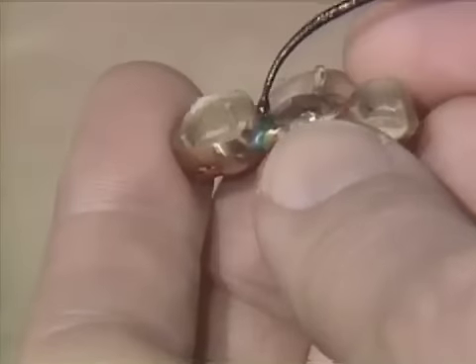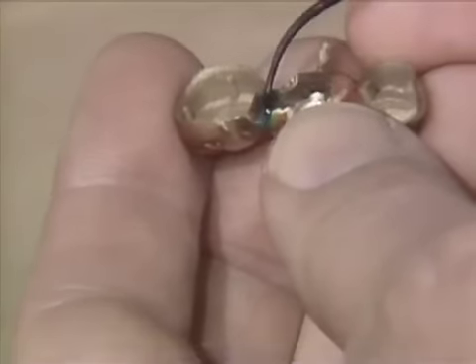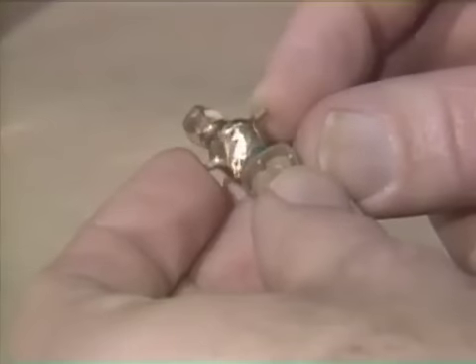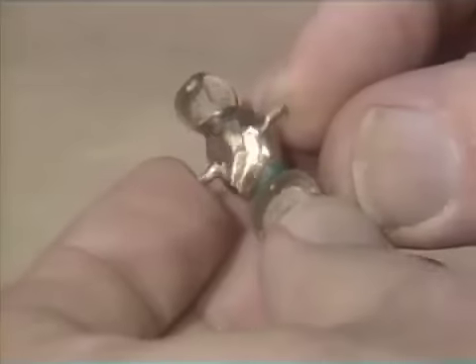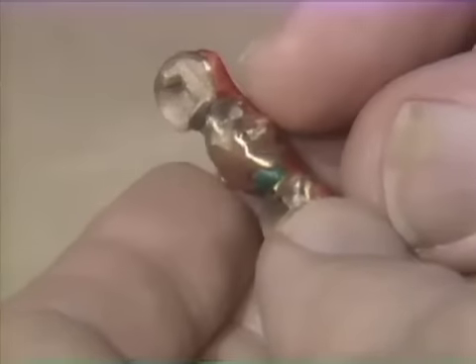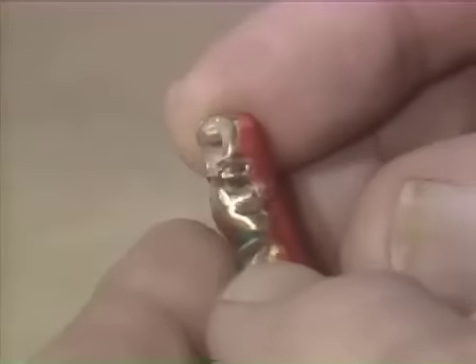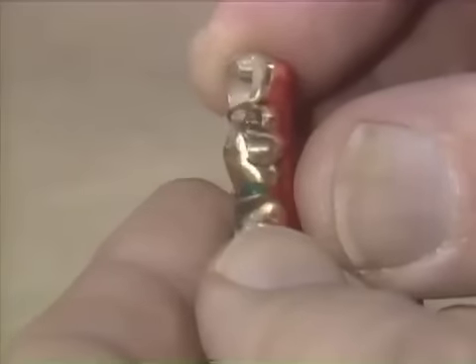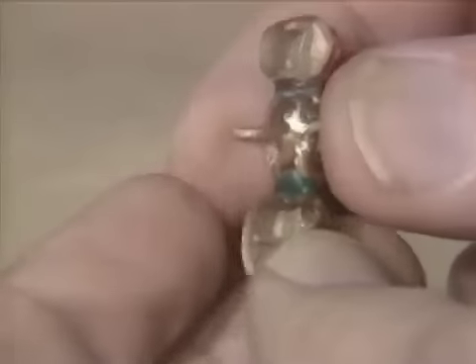Once the distal area has been done, we'll do the mesial. Now we've finished blocking out the solder joint area for the bicuspid. Notice we stayed away from the cervical margin of the retainer, came back up the lingual. As you come out to the buccal on that slice area, you're going to be very, very close to the edge of that slice. Do not take your block out all the way to it — leave at least three quarters of a millimeter of that margin exposed with no wax on it. This is what you want to block out the area for the solder joints. We're now ready to invest this.